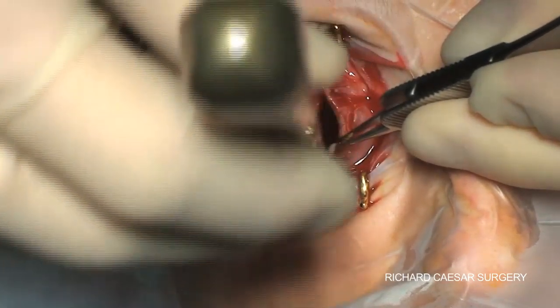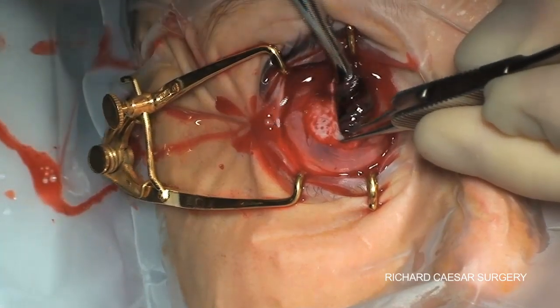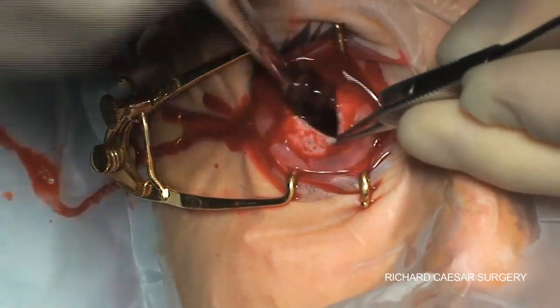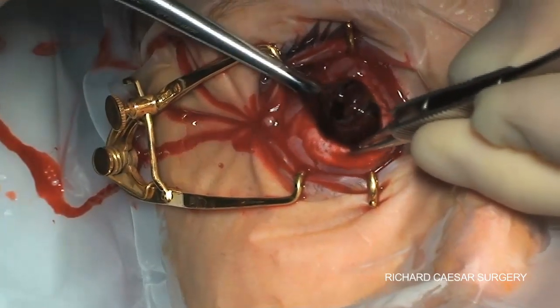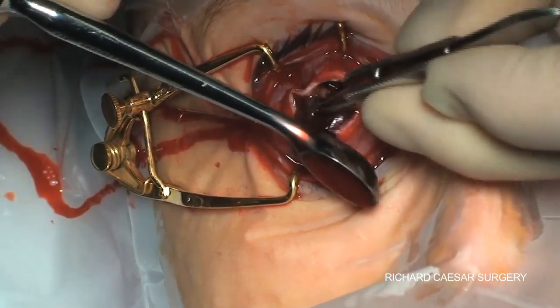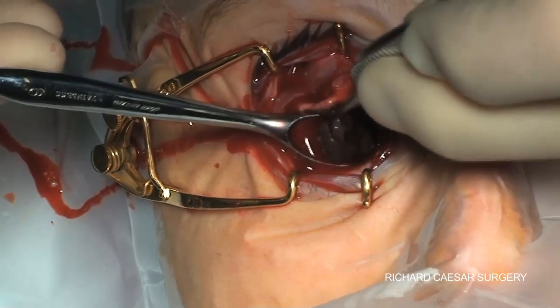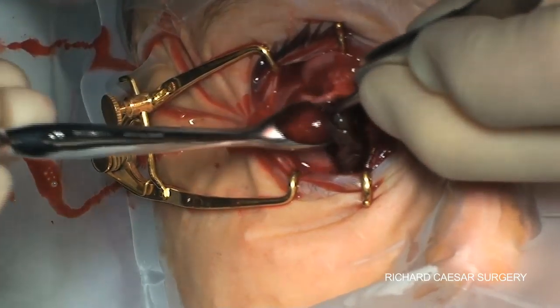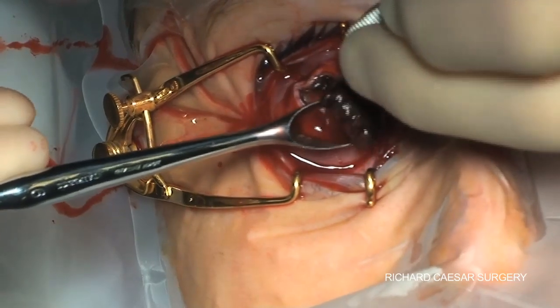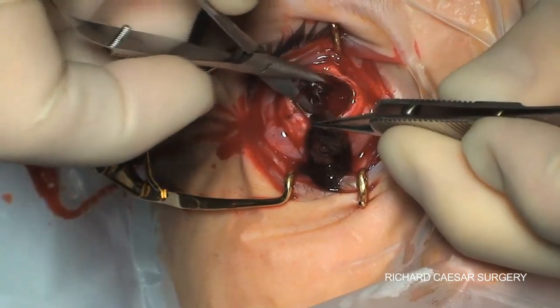This is always a rather gruesome stage, but the spoon needs to be swung right round and the full uveal tissue removed. Here it's mostly coming out effortlessly, and then there's the area of the previous surgery where the uveal is adherent to the sclera. This ultimately needs to be snipped off again using the spring scissors.